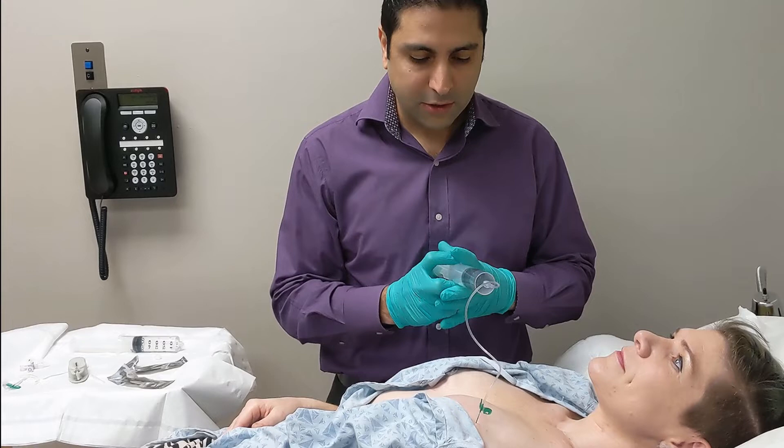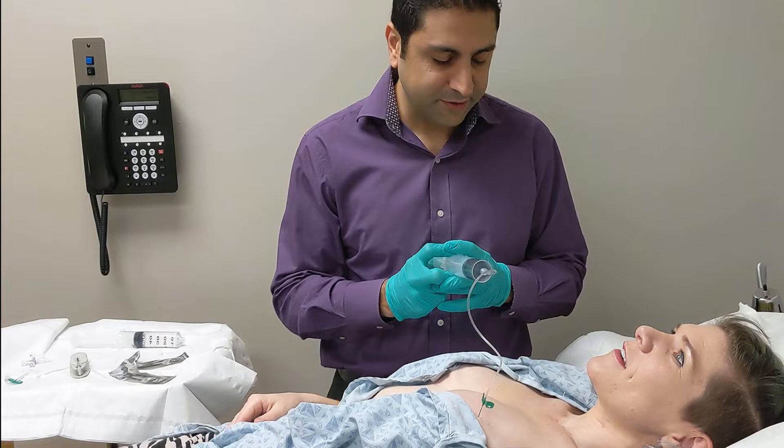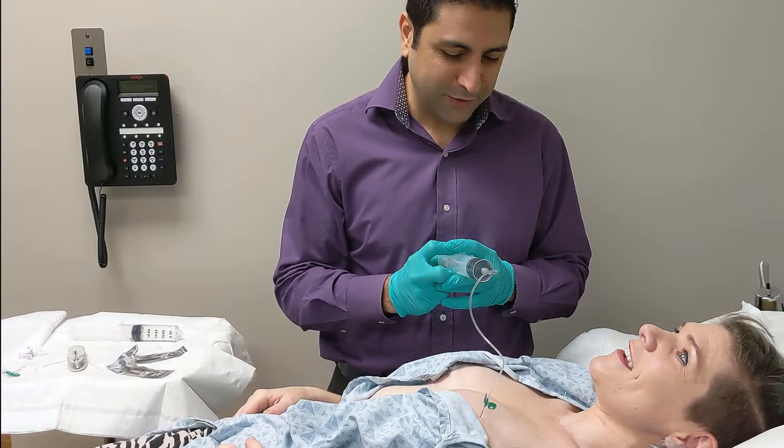As I do this, you can actually physically see the breasts starting to expand. How does that feel? I don't even feel it. And that's what we're going for — minimal pain, minimal discomfort.